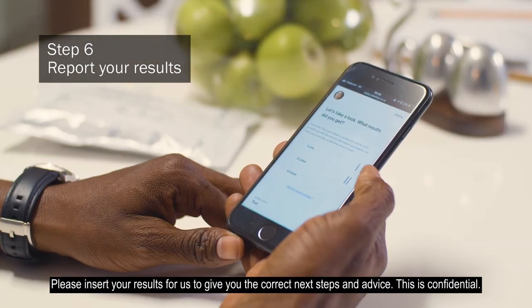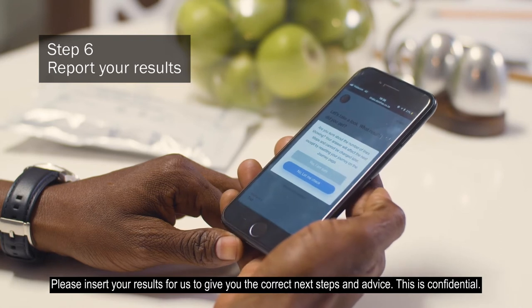Step 6: Please insert your results for us to give you the correct next steps and advice. This is confidential.